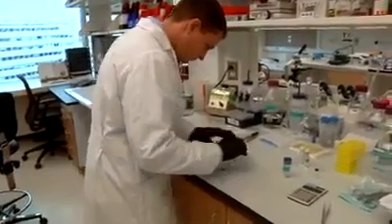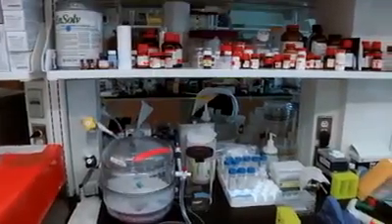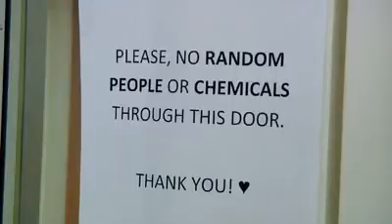Dr. Kohani and Dr. Ciolino's method is to embed their drugs in a polymer, which then sits like a sandwich inside the contact lens material called hydrogel. Basically, the drug is trapped inside this, both the hydrogel and the polymer disc, rather like a fly in amber, or actually very much like the red coloring in Jell-O, and it just very slowly releases over time. The cloudy polymer containing the drug is kept in a ring around the pupil, so normal vision is not impaired. Then, carried by tear fluid, the drug simply permeates into the eye.